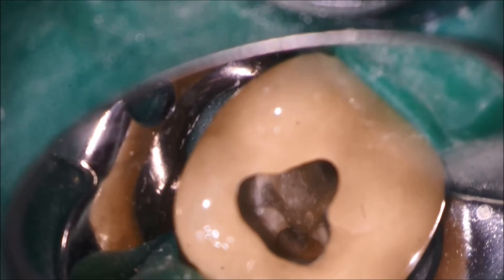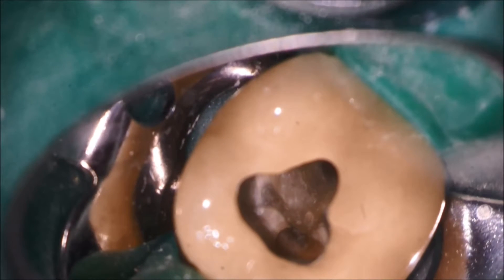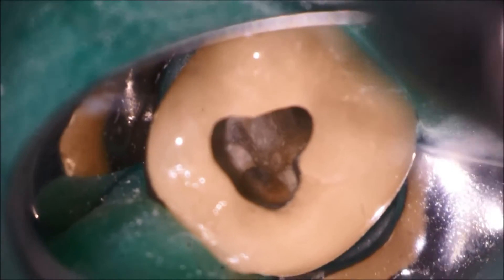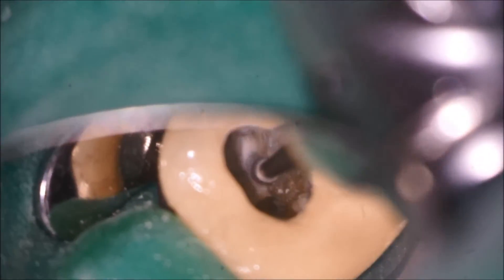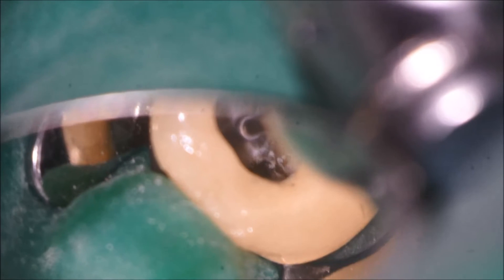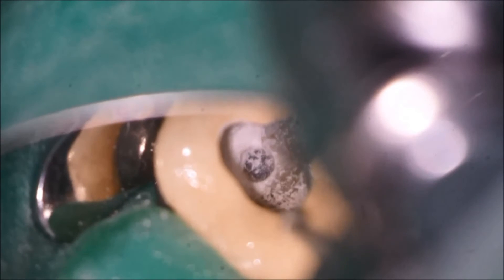The superior lighting and magnification of a microscope allow you to see where the canals used to be. Under the microscope, using a small round burr, we're able to begin to excavate the calcified canal.